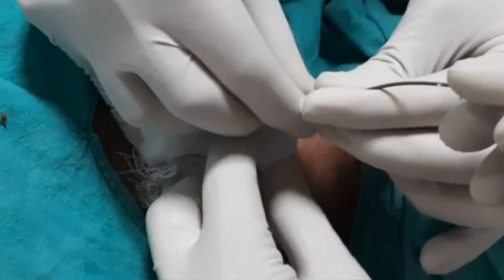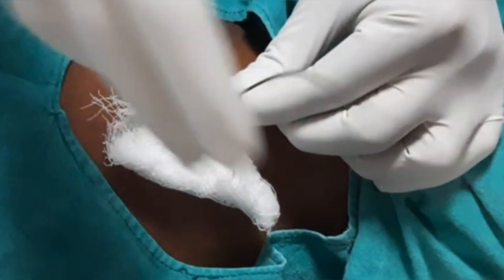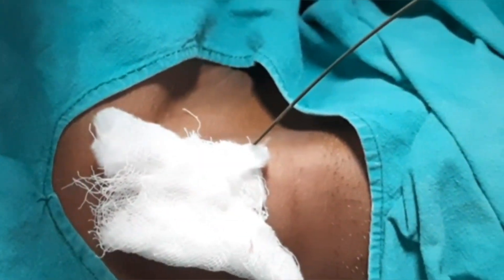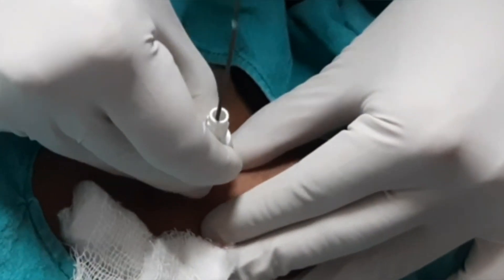Now we insert the guide wire, directed downwards. We have kept our needle bevel like that so the guide wire goes downward only. You can see the white mark. Now we will remove the sheath and insert the short dilator — I told you this is 14 French.